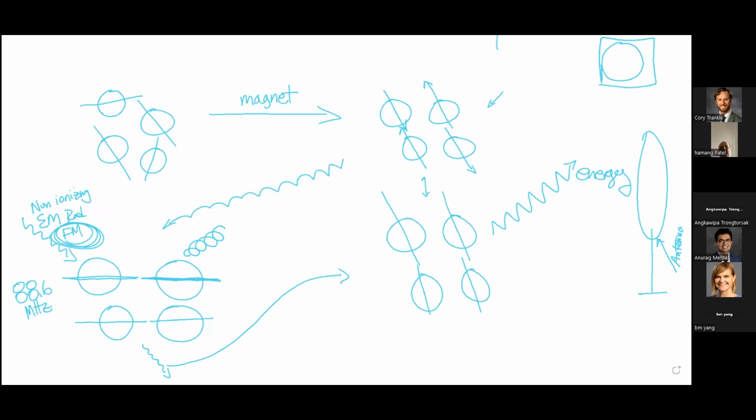Some of the antennas can be in the bore of the scanner. But the other ones, if you notice, and I'm going to have a person laying in here, there are the arms. You'll see us put this foam thing on top. Well, that's a surface coil, and that also has antennas in it.